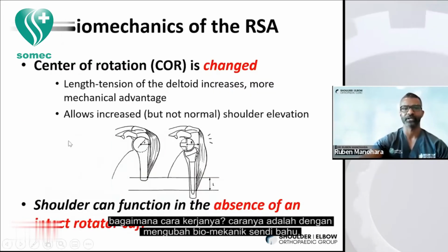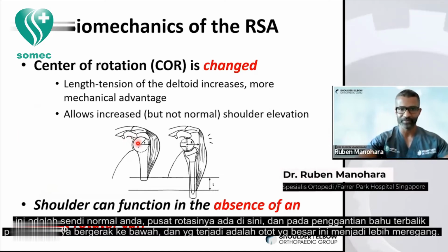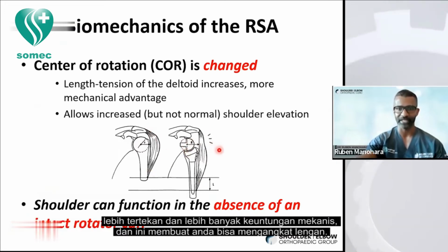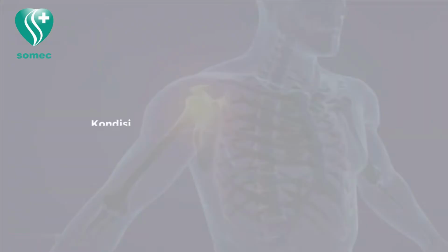So how does it work? Well, it works because it changes the biomechanics of the shoulder joint. This is your normal shoulder here. Your center of rotation is here. So in a reverse shoulder, the center of rotation is moved down and inwards, so it's down here. And what happens is this big muscle, the deltoid, becomes stretched, with more tension and more mechanical advantage. And now your deltoid can cause you to raise your arm. So your shoulder can still function even if you don't have a functioning rotator cuff.